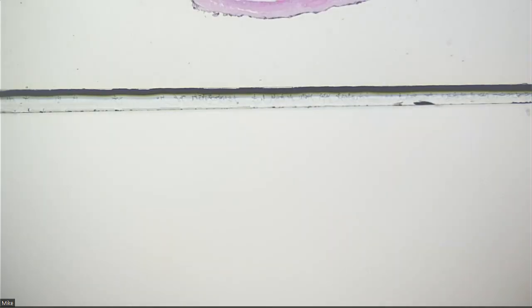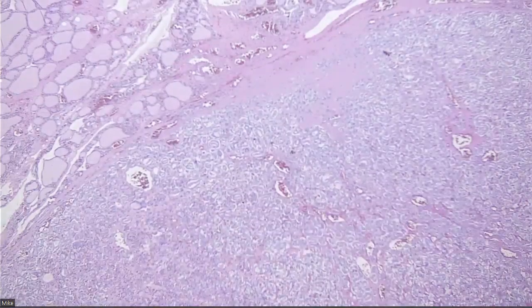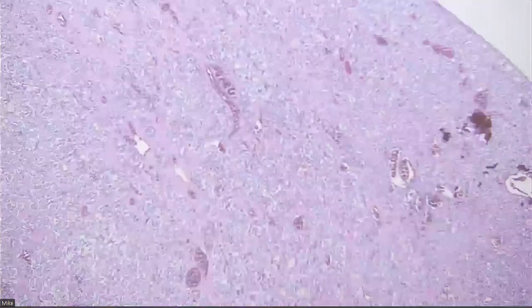That is always the first step that I would do when trying to figure out if something is truly PTC or not. And this is one of the rare, really, really well circumscribed papillary carcinomas that grows in 100% follicles, in which BRAF V600E is going to be extremely helpful if you don't already have that information based on the FNA, because the pattern is so follicular and the thing is so circumscribed, right? Usually your PTCs aren't going to have this problem.